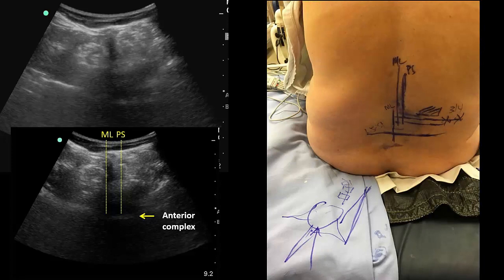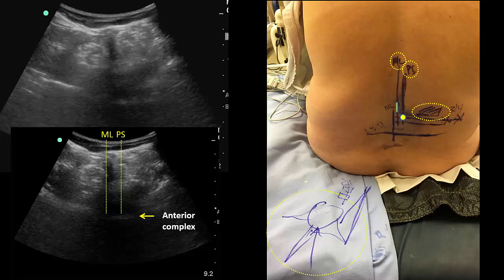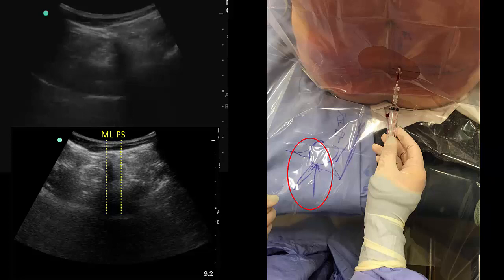The location of this transverse plane and the corresponding positions of the midline and paraspinous line are marked on the patient's back. The intended insertion point is at the intersection of the paraspinous line and the horizontal plane of the beam, in line with the visible anterior complex. I have also marked the position of the spinous process above the space with a hatch rectangle, to give an additional guiding landmark should I encounter difficulty and need to make redirections. I have also found it helpful, particularly for trainees with patients in the sitting position, to mark the angle of the probe and the degree of rotation on the surface of the bed to provide guidance for needle redirection. As expected, a 25 gauge needle inserted perpendicular to the patient's back enters the space successfully in a single pass. Note that this corresponds to the sketch that was made during the scanning process.